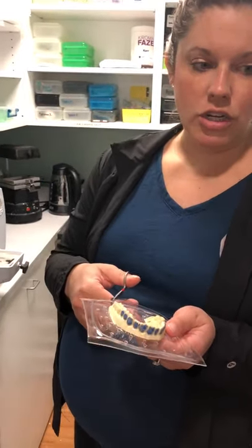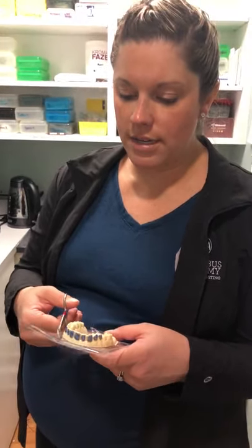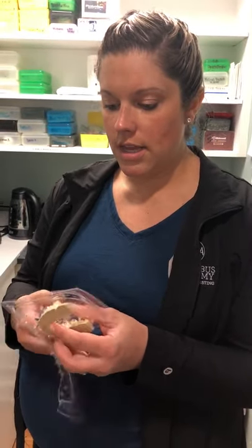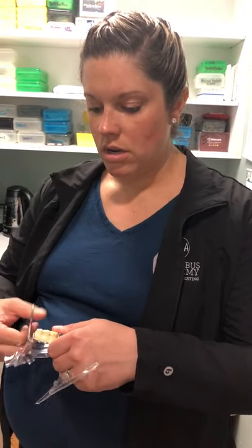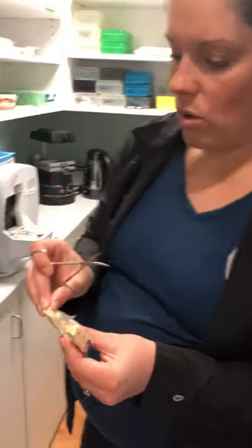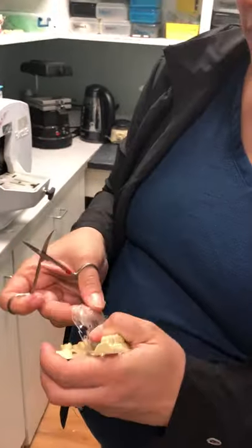Now we're gonna go over how to trim your model or your bleaching tray. What you want to do is cut in here — you're gonna cut all of your excess material off first, just like this, with your scissors. That's just gonna help get rid of all that. Then you're gonna take your bleaching tray off your model.